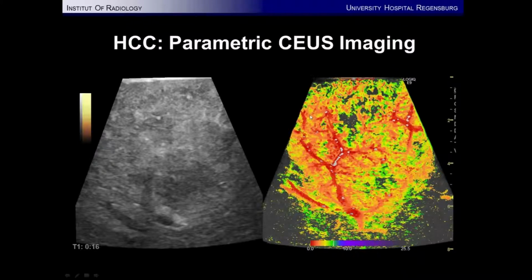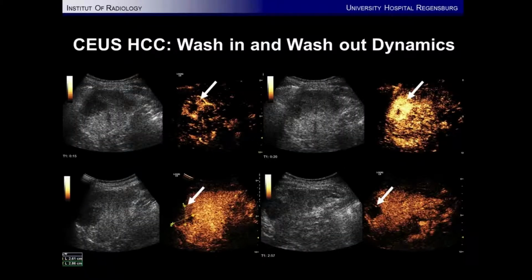Look at this, the next step. We have to use new technologies like tumor perfusion imaging and color-coded imaging. You have an excellent view of the feeding tumor vessels and can plan on which side you should perform the embolization. On the next step, what does characterization of HCC lesions mean?